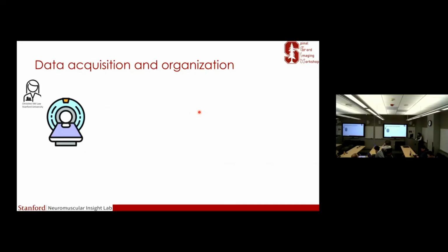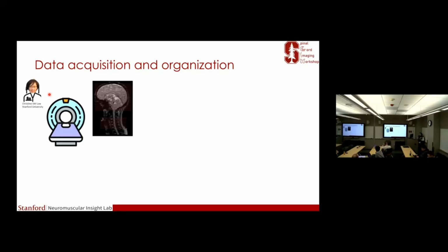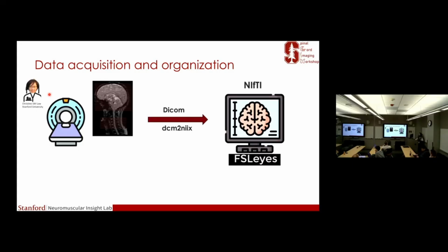And let's look at the workflow. So let's imagine Christine, who talked about corticospinal fMRI acquisition, and she is collecting corticospinal fMRI data at the scanner. And I would say this is the workflow that she can adopt. As you know, everyone's institutions are different, but I assume mostly from the user perspective, unless you are physicists who are really into MRI physics, we get the DICOM images from our institutes, from the scanners, and then we convert them to NIfTI format.